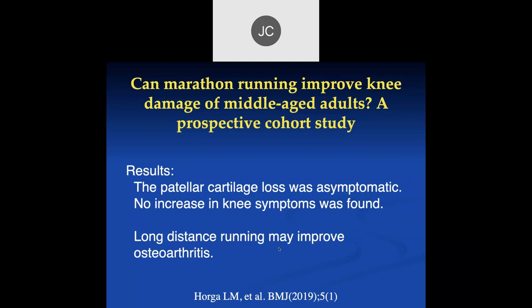I don't remember if that was in the study. Yeah, these are all things that most people sometimes forget to put in. These were considered healthy, so they probably didn't have a lot of knee pain, though they had a lot of changes, subchondral bone edema changes on the MR scan. Some of them did.